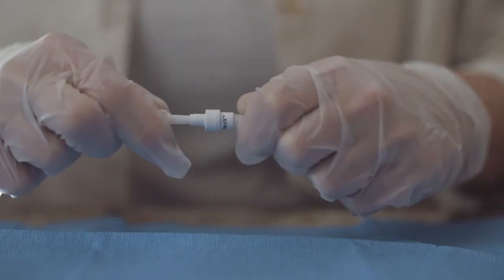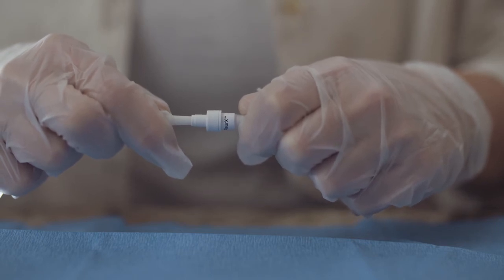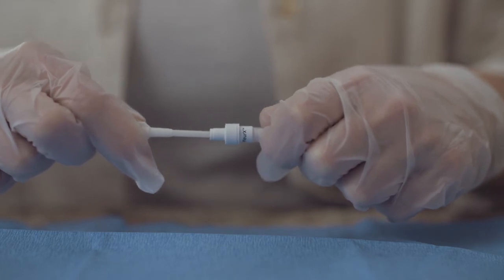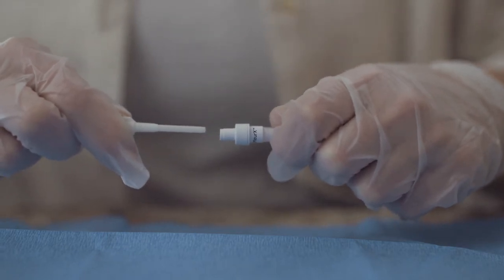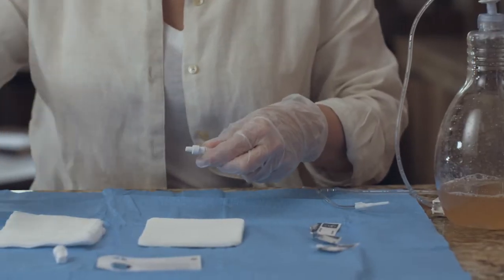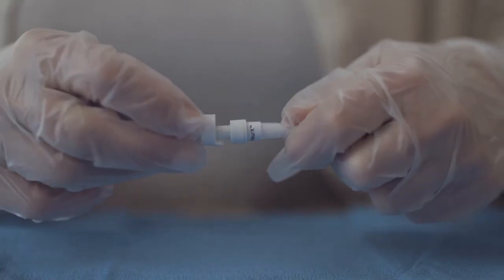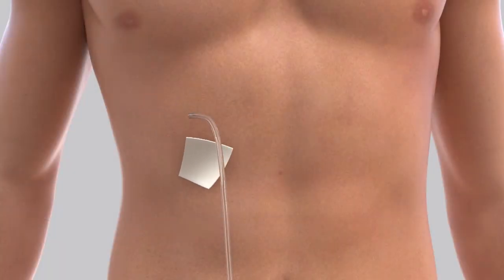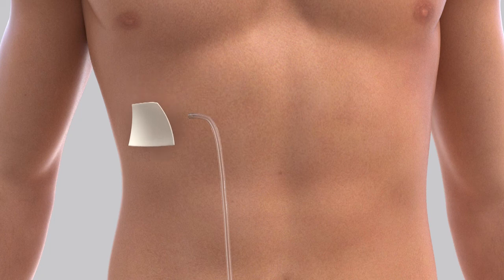When drainage is complete, disconnect the drainage bottle from the catheter by holding the drainage line near the access tip and the catheter near the end. Then pull the access tip out of the catheter. Clean around the opening of the catheter using a new alcohol pad and twist the new cap into place until you feel a slight click as the cap locks.